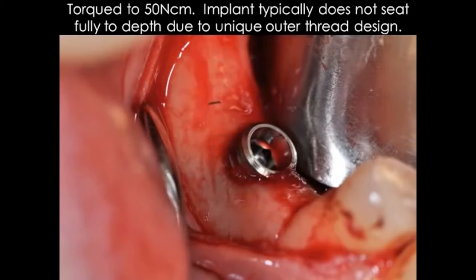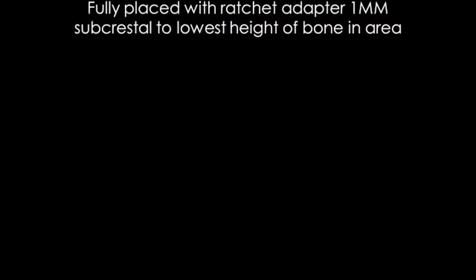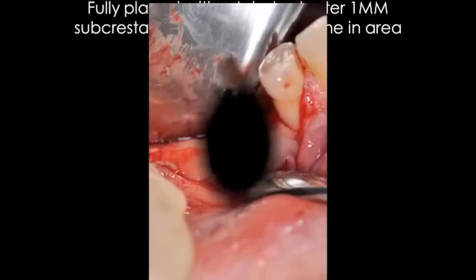With this particular implant system, you always get phenomenal torquing or initial primary stability with this implant. Typically, it does not seat to depth. It's about 1 to 2 millimeters short of your final depth, and then it typically torques out to 50 Newton centimeters very quickly, and then you will actually place the implant to depth utilizing your ratchet adapter, or what other people call ratchet extension. There you see the ratchet extension in place.